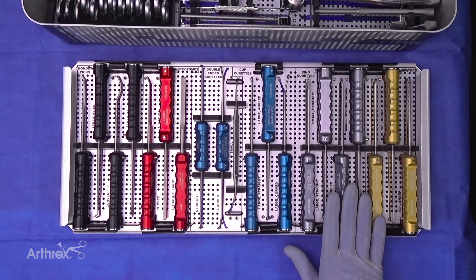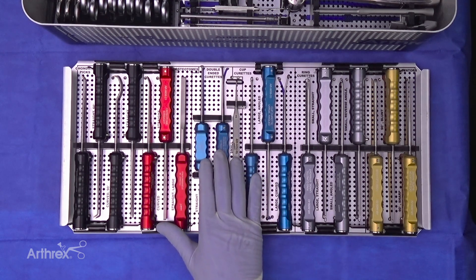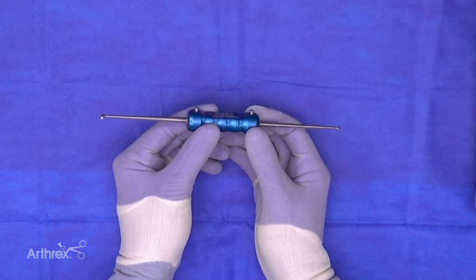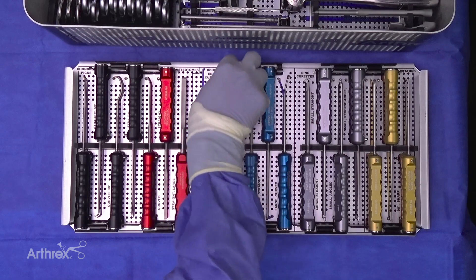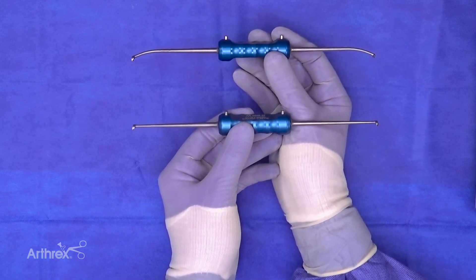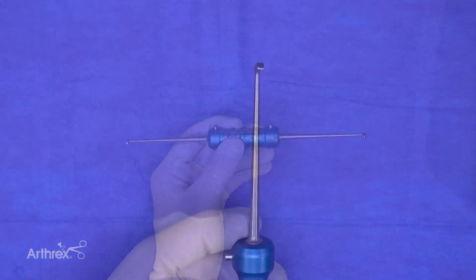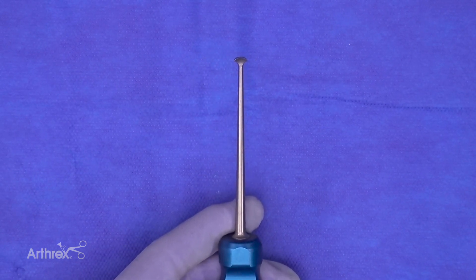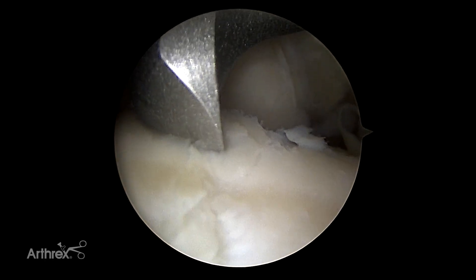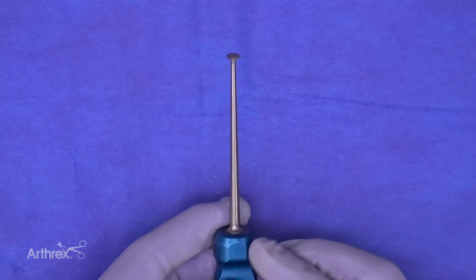Shifting gears to curettes: the set has a vast array of cup curettes and ring curettes. Let's focus specifically on the first three curettes, which are all brand new. These are double-ended curettes — we have a double-ended straight and a double-ended curve. The geometry of the heads is exactly the same. These instruments are shaped like a garden hoe and are going to be really helpful when a surgeon is trying to make a nice rim around a cartilage defect.